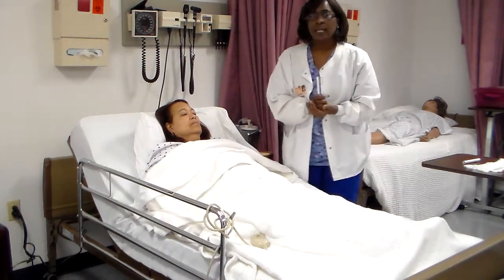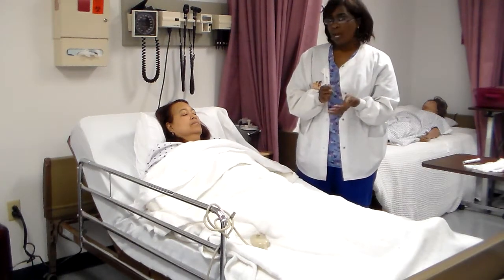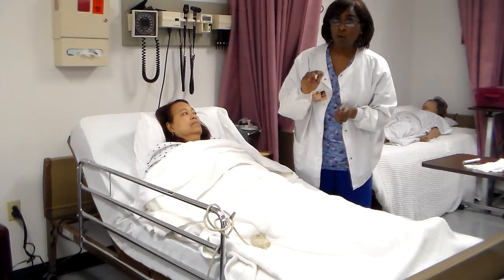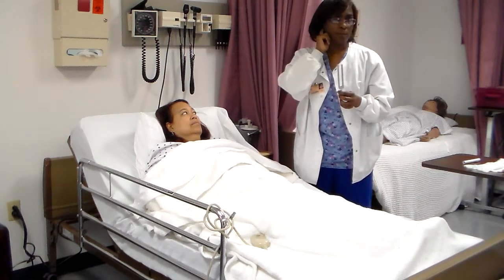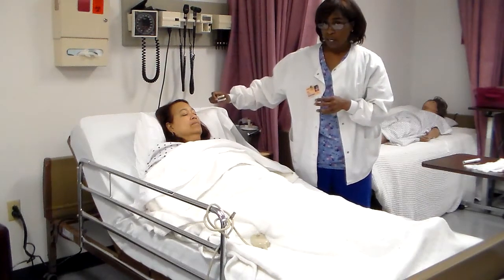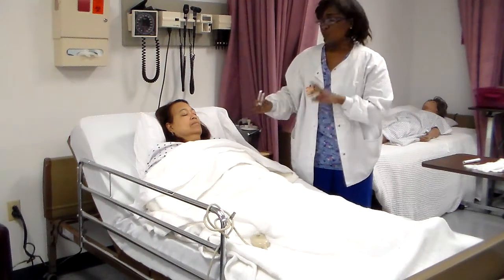The next test that I will be doing is called the Rinne test. With the Rinne test, I will take the tuning fork and hit it, and I'm going to have Ms. Rivers put her finger up when she can no longer feel it. You will place the end of the tuning fork on the mastoid bone. After she can no longer feel it, I will place the tuning fork in front of her ear, and once she can no longer hear the vibration, she will put her hand up again.